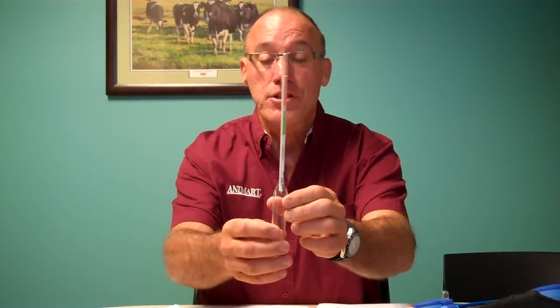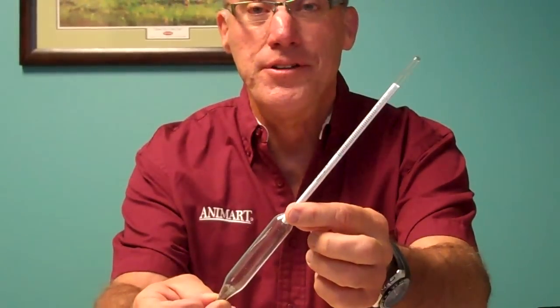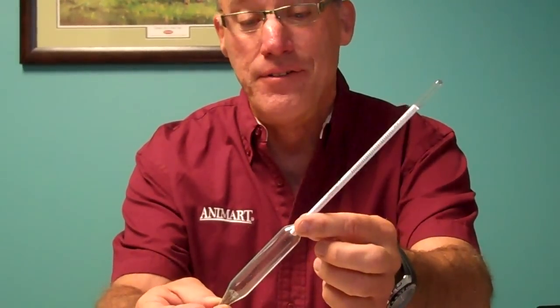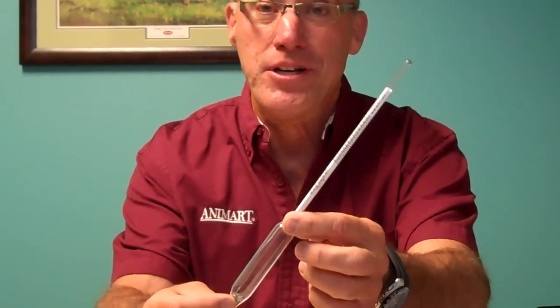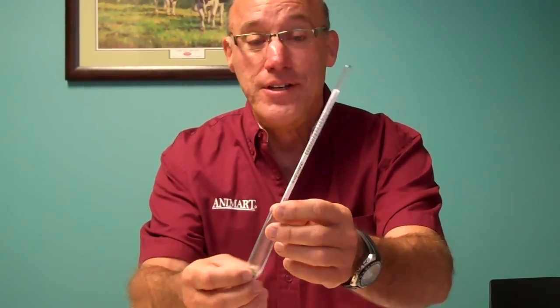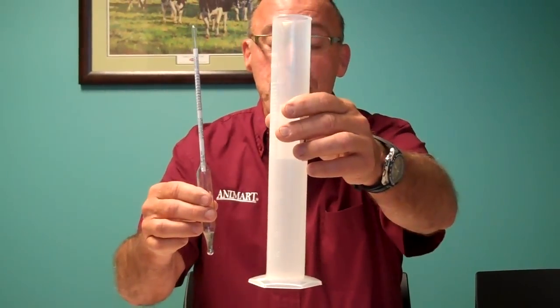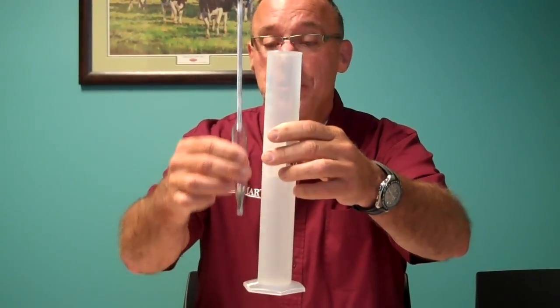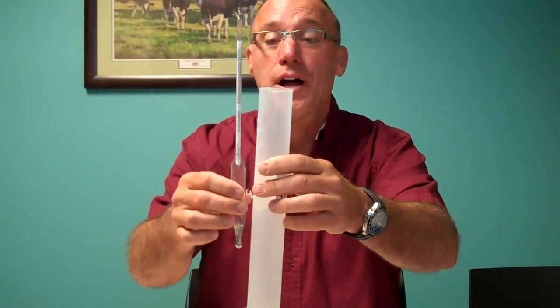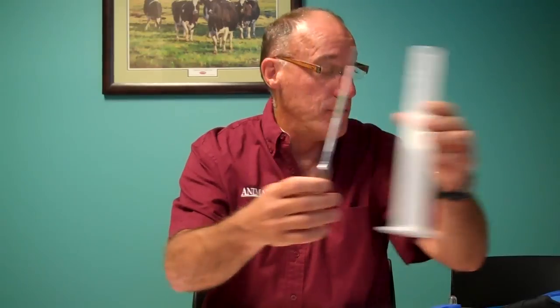Traditionally for measuring colostrum quality we use this here, which is a colostrometer — very breakable, easy to destroy, and actually fairly expensive, so if you break too many of these it's fairly costly. You just put colostrum in a tube like this, get it to room temperature, and then figure out how good the colostrum is by where it floats along these lines on the colostrometer.